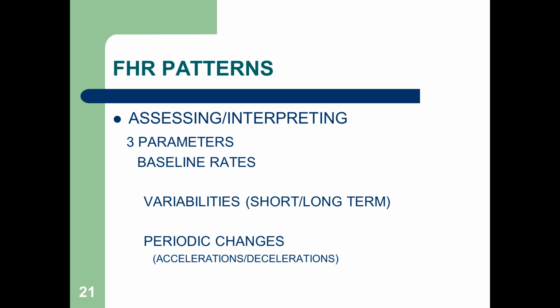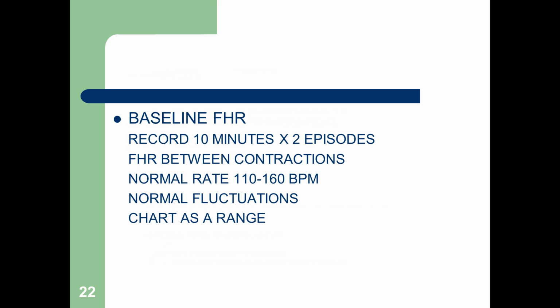Fetal heart rate patterns. Let's look at assessing and interpreting these patterns. Now, your book does a very fine job of showing you pictures of accelerations and decelerations, and again, we're just going to go over these, not spend a long time with them, because when you're interpreting fetal monitors, that is a skill that has to be cultivated. It takes time and it takes practice. So I'm basically concerned with us knowing the more common strips, and I'll point those out as we go along, okay?